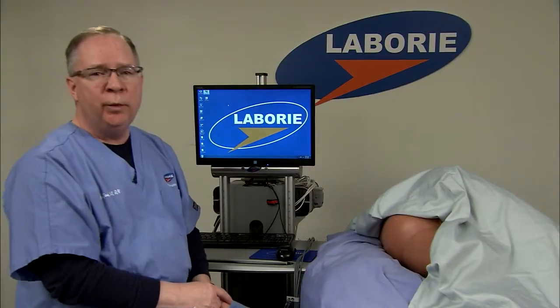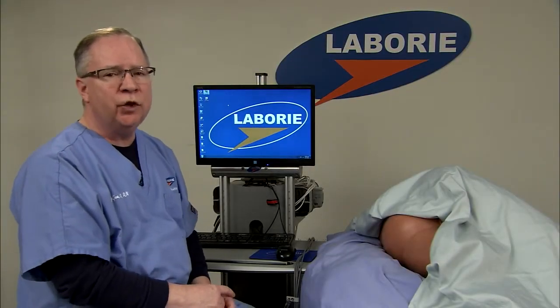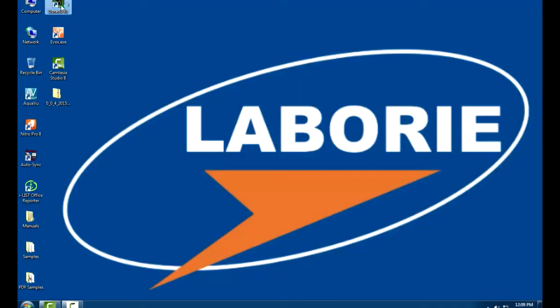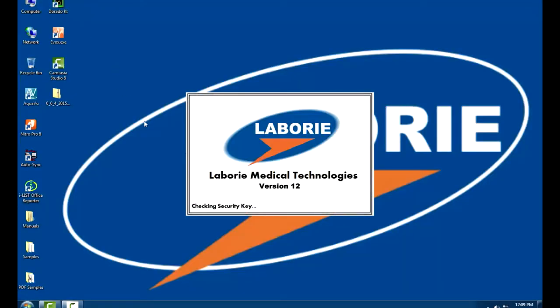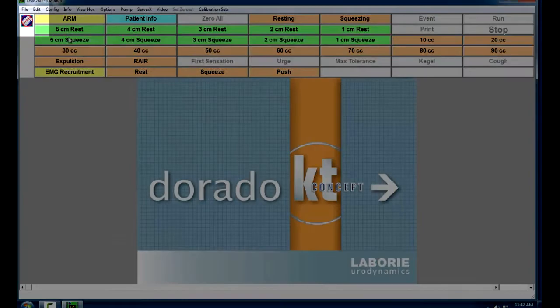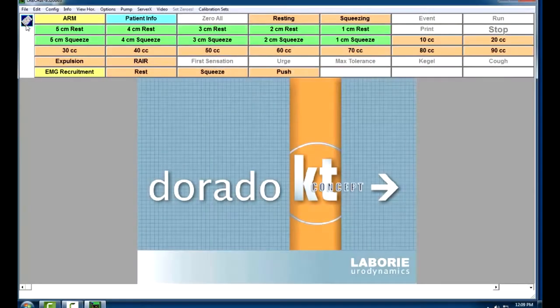Now that the patient is prepared, let's go ahead and move to the software and start our procedure. To start the program, we're going to double-click on the Dorado icon. You always want to make sure that this little red circle up here in the upper left-hand corner disappears. We need it to be so that the red circle is gone. That means the two components of the computer are speaking to each other.